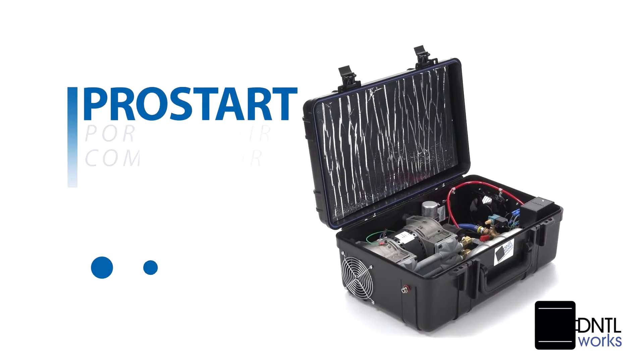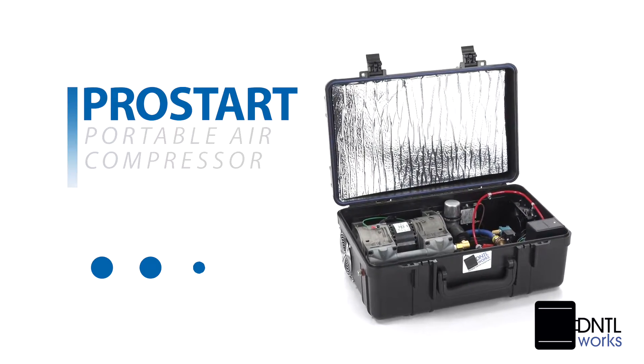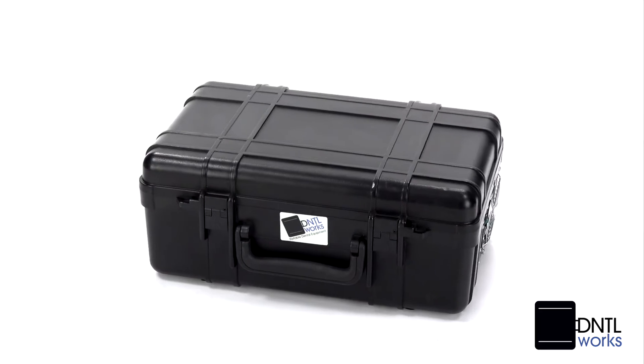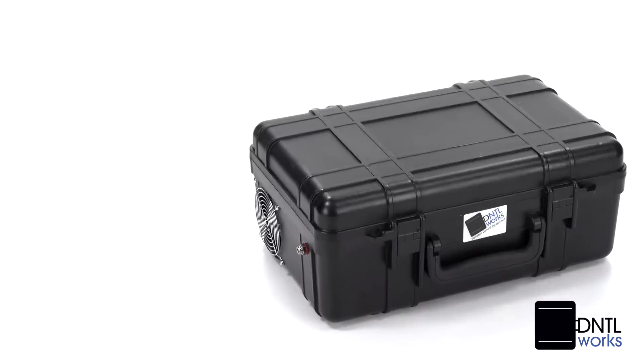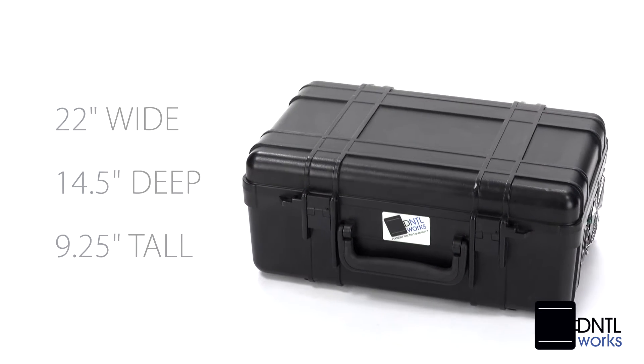Our Dental Works ProStart oil-free portable air compressor is an ideal fit for professionals on the go. Its rugged ABS polycarbonate style case is compact and lightweight at just 37 pounds, with measurements of 22 inches by 14 and a half inches by 9 and a quarter inches.